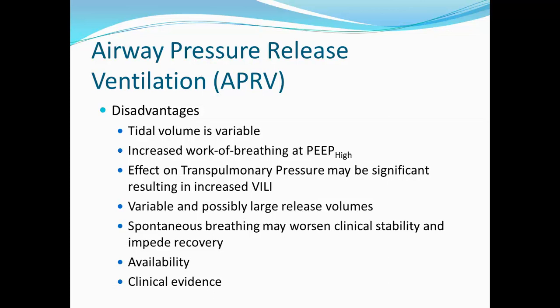Another problem with APRV, I believe, is the availability of APRV. APRV, as we'll talk about a little bit later, is not the same thing as biphasic, is not the same thing as bivent. I think there is a difference between the different ventilators, the way that it actually applies the pressure release, the fixed T high, the fixed T low in patients.